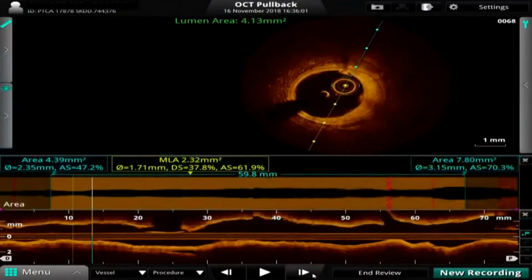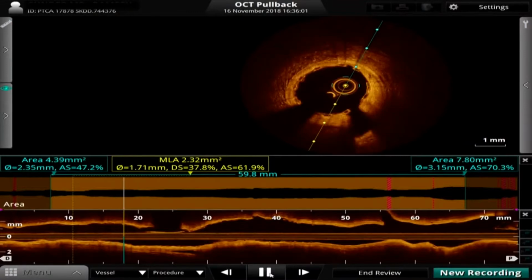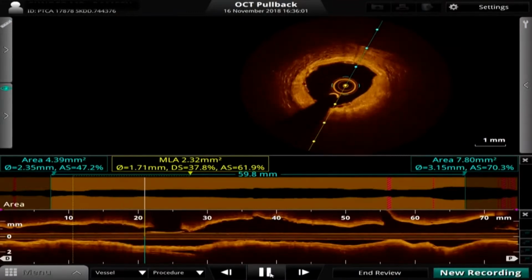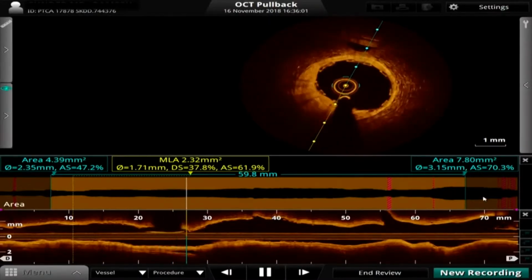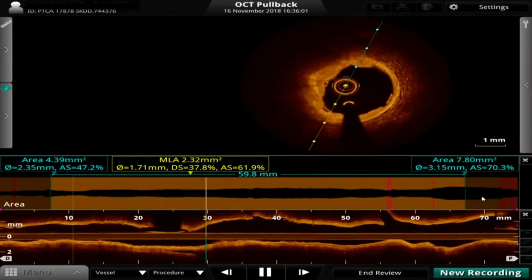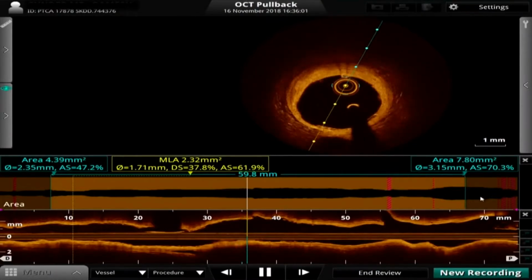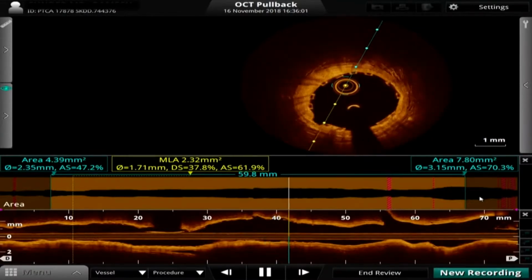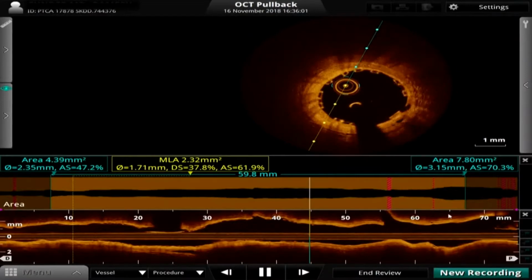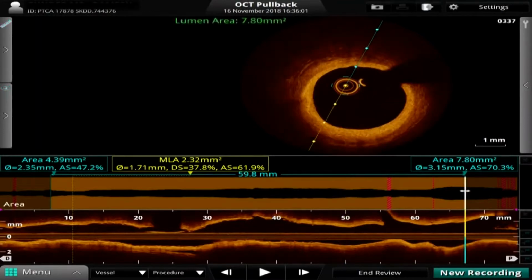Can you just scroll through the stented segment so that we see the apposition is good? So that's the distal segment. You can see it is very well embedded. The small squares of the scaffold are there. And all the way we are coming to the proximal segment. You could see that there is one small area where the apposition was not good. Here again, a branch. So it's not very significant, but this is where the scaffold ends. So I think it's very well apposed.